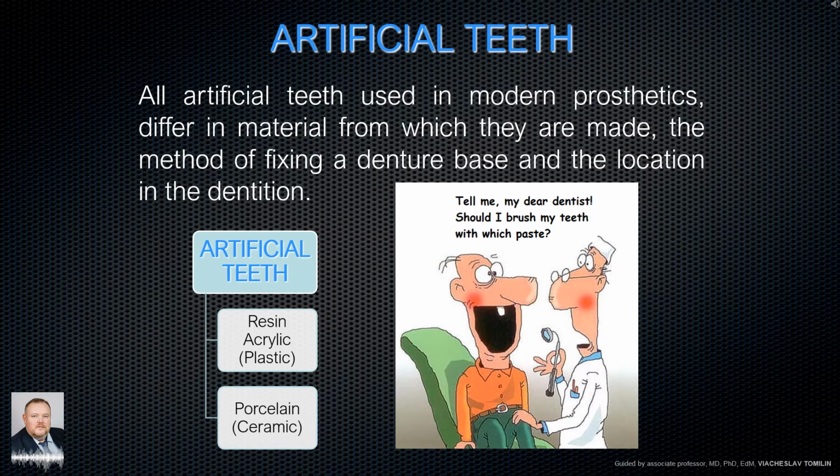They have a chemical connection with the denture base, and the technology of their production is much easier. Modern acrylic teeth can be in different shades, they look like natural teeth, have increased strength, and of course they are much cheaper than porcelain, ceramic teeth. In comparison with plastic teeth, porcelain teeth are slowly erased and much more color stable, and better simulate the natural teeth. Plastic teeth, without the risk of a split, can be ground off without any restrictions, and if necessary, built up with fast hardening plastic.